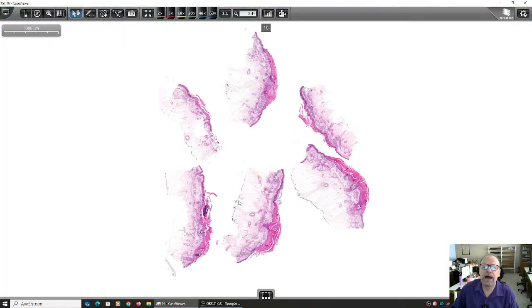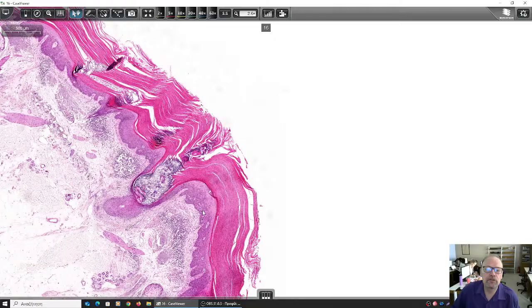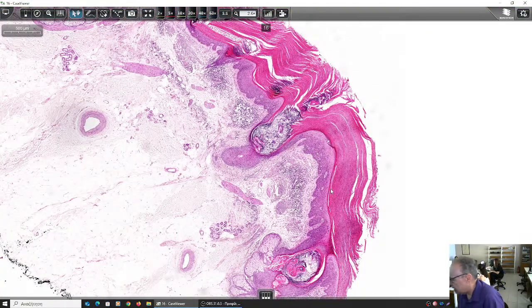Now, let's have a look at this lesion. This appears to be a lesion of the epidermis. Okay. Is there something you remark here that is abnormal and we can see in this low magnification? Is there a layer of the epidermis that looks thickened or abnormal? Which layer here appears to be rather prominent among all the other layers of the epidermis? Which one does it appear to be more prominent?